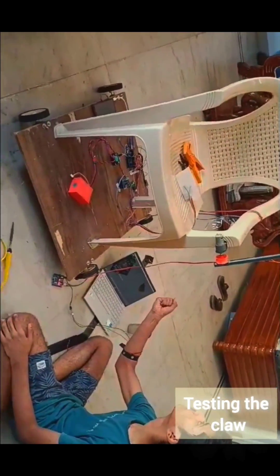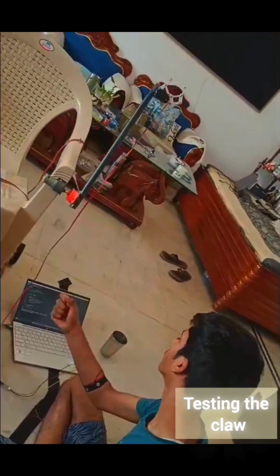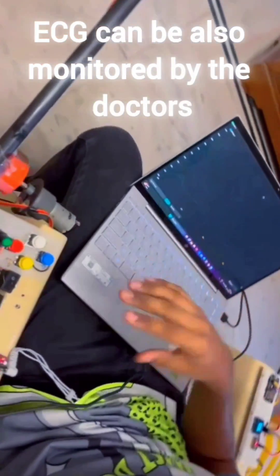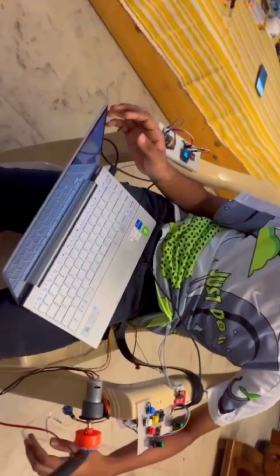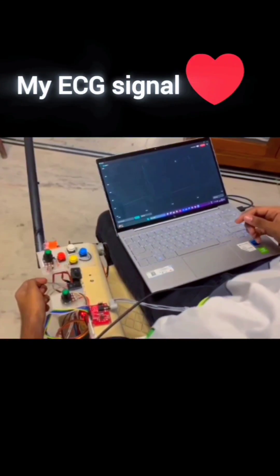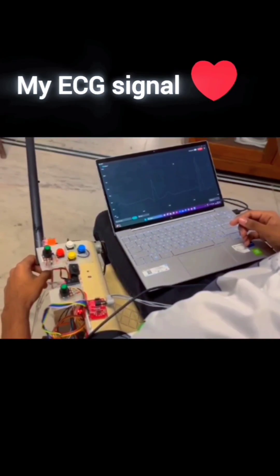This was me testing it — it was in the testing phase. Now this is the ECG monitoring, which can be monitored by doctors via the internet on their laptops or phones. This is the electrode placement. This was my own ECG signal — I connected the electrodes as shown in the figure.